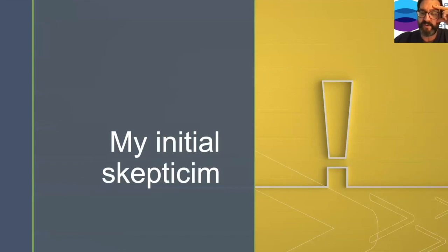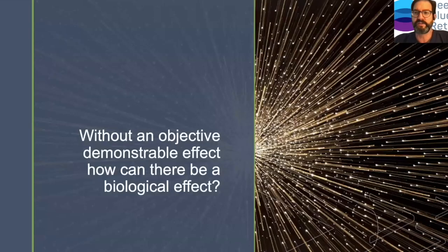But nevertheless, even though it makes sense from a physics perspective, I will admit I was very skeptical at first. I was trained and worked for a decade without using micropulse laser, using a standard continuous wave laser. And when I had my hands on the first machine, I wondered if this is just mumbo jumbo. And one of the problems that I had is when I spoke to people, they said, well, you can laser through the fovea and you will never see an effect.